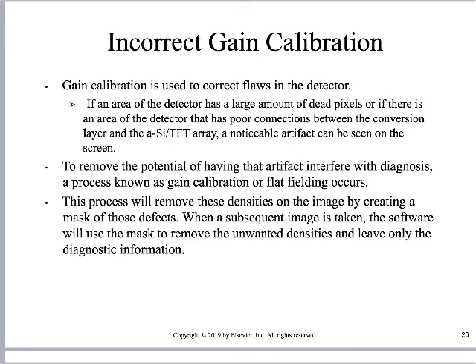So the way that we would correct for it is basically to do the Instagram effect to the detector, right? It will mask those defects, and hopefully it will not obscure information that we actually need.